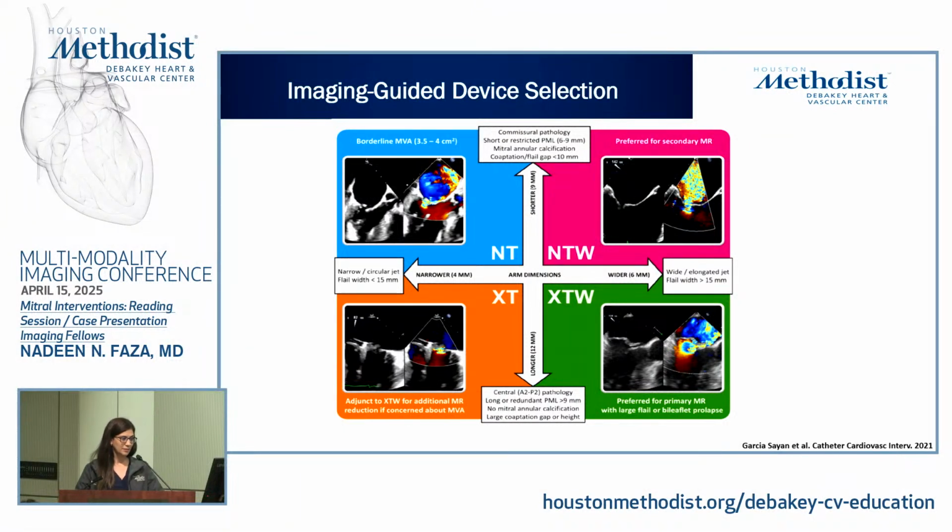And this is a figure, basically. You don't need to know all the specifics, but it shows you that your baseline imaging can help determine which device is going to be used for the intervention.